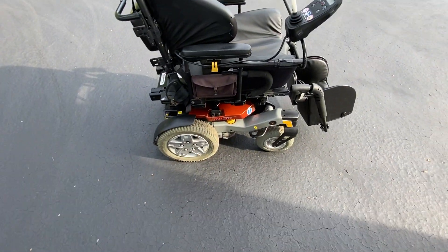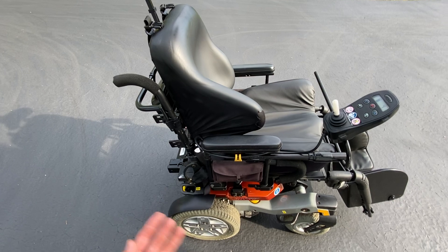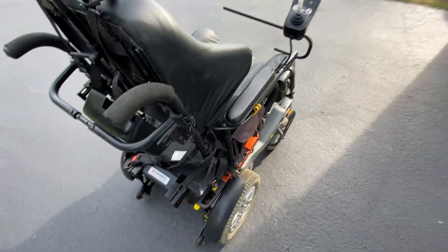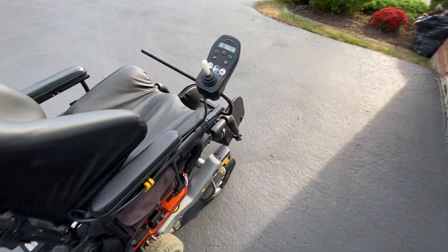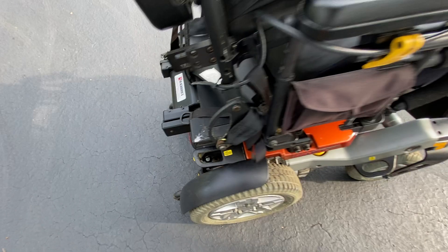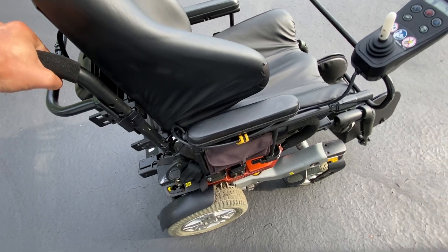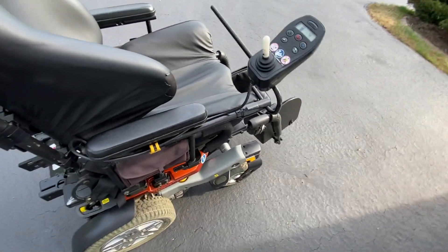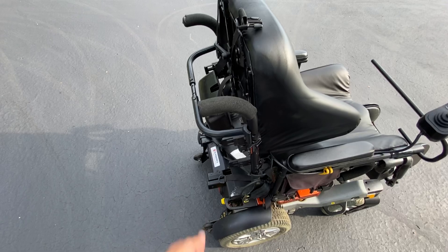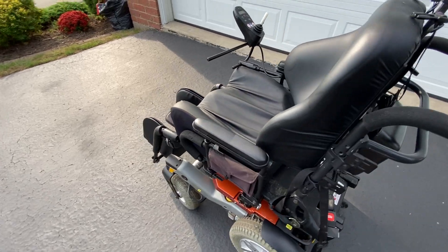It is a four-wheel wheelchair, as opposed to the common six-wheel wheelchair. It's based off an older but tried-and-true design — rear-wheel drive, four-wheel chassis with anti-tip wheels in the back. This chair is an incredibly heavy chair, probably weighing close to 250 to 300 pounds. You can't lift it or move it by hand except for pushing it when it's in neutral.